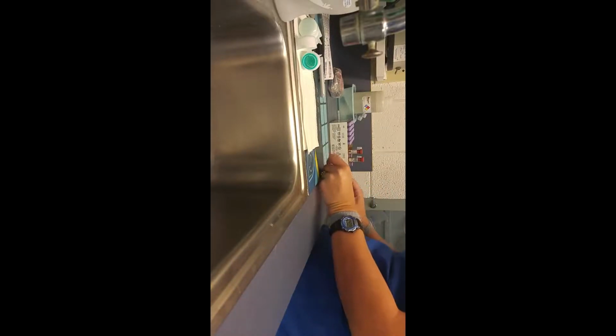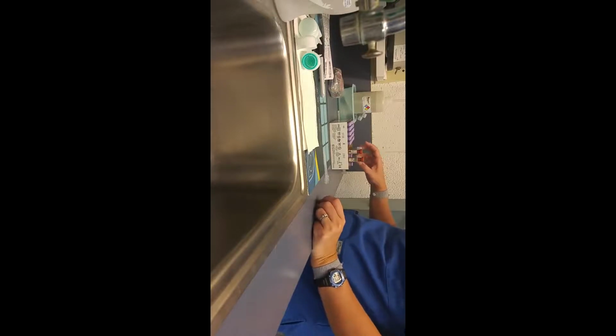So the next step is going to be to wash the blood left in the EDTA tube. So I've got two more little pipettes that I'm going to use. I'm going to put them in a disposable test tube. I've got them labeled.